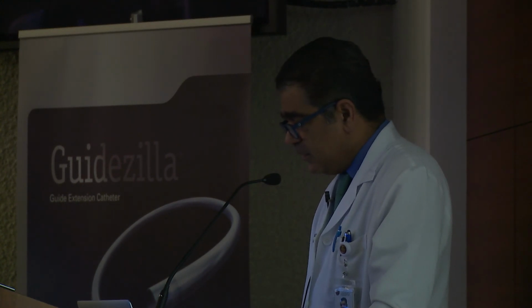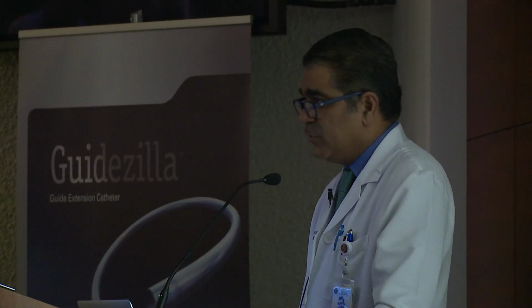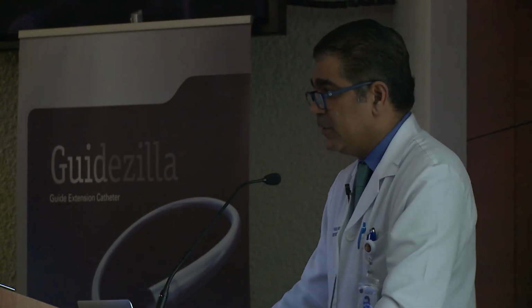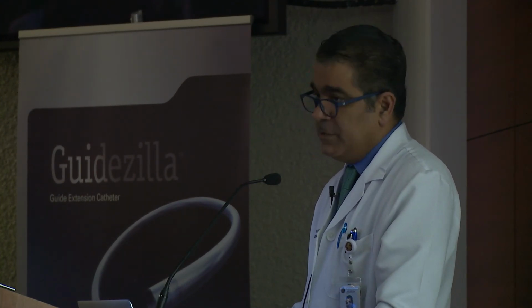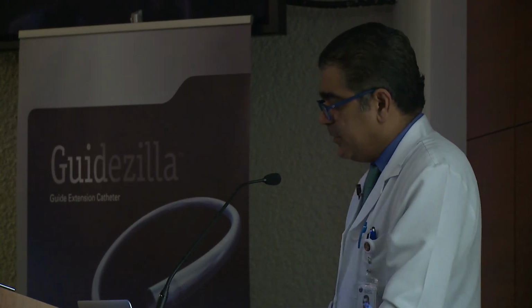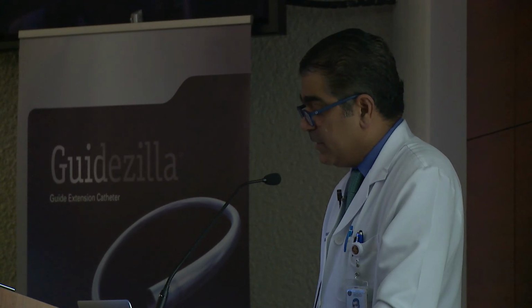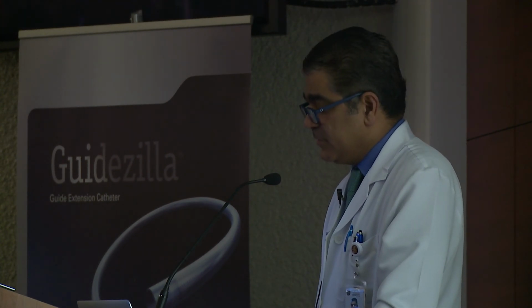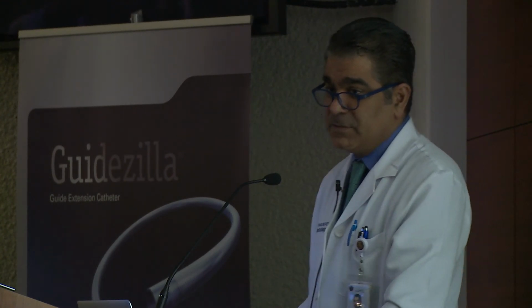So this is how the septals are assessed. But then the question would be, what is an ideal septal? This is an ideal septal, taken again from James' book. An ideal septal is one where, from the donor artery, you have a fantastic angle to access it. The collaterals have no tortuosity, no branches, and the exit of the septal is excellent. But of course, that does not exist in reality.